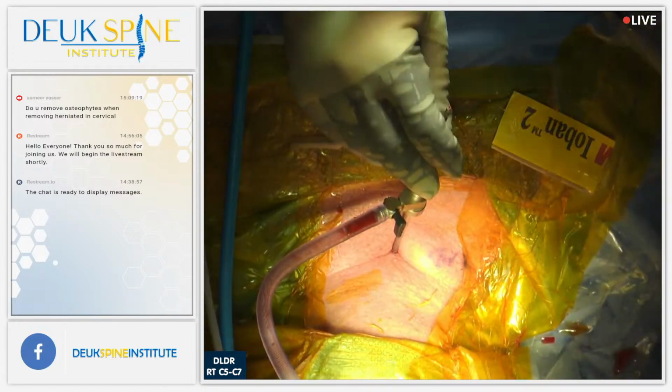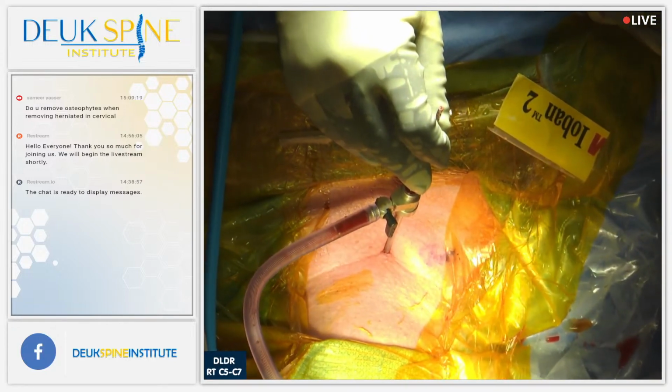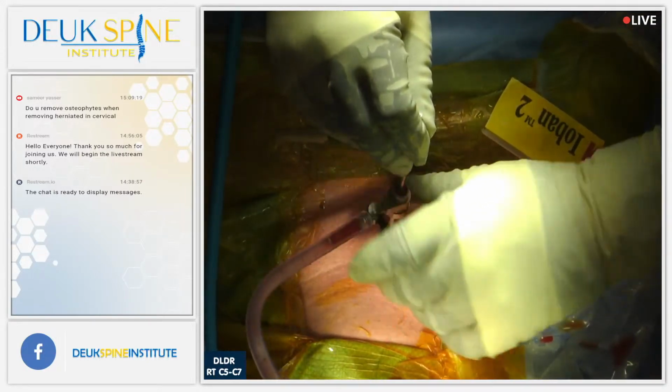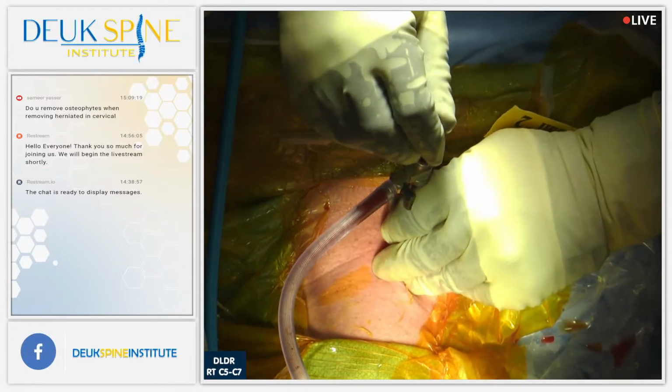All right. Whenever you're ready, Dr. B. All right, I'm ready. Shot? All right. That looks good. Just stay there for now. The AP view is not the problem. It's the lateral view, as always.